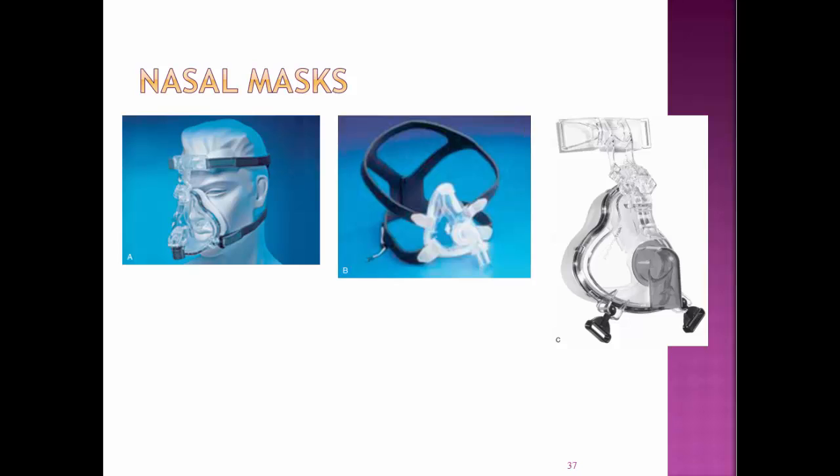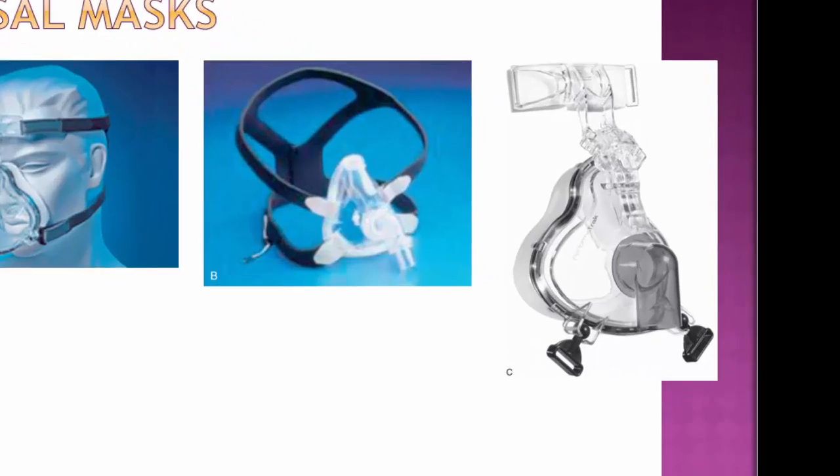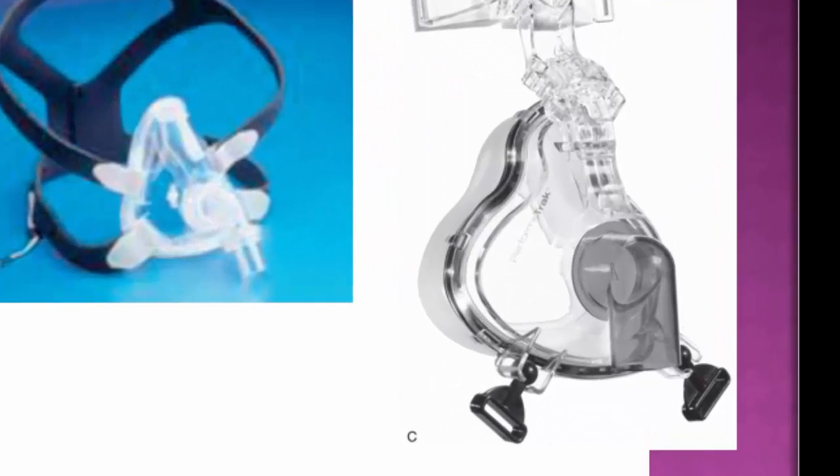Okay, these head straps occasionally have just Velcro attachments, or like on the right-hand side here, this allows you just to snap it in place and you don't have to adjust the Velcro every time.